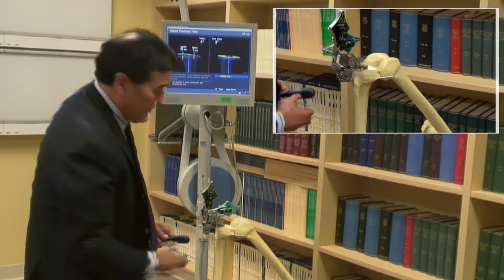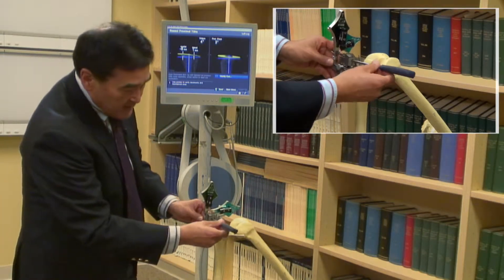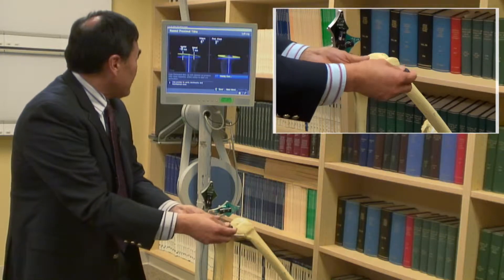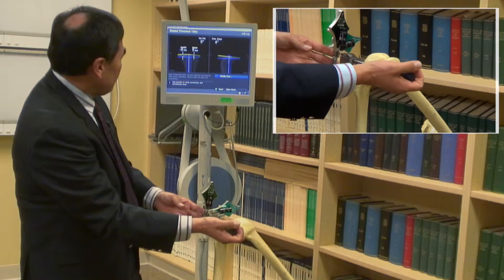On the right screen, we adjust the posterior slope to 3 degrees, and the varus/valgus. This plane gets adjusted with this screwdriver to make the bony cut 90 degrees to the long axis of the tibia.